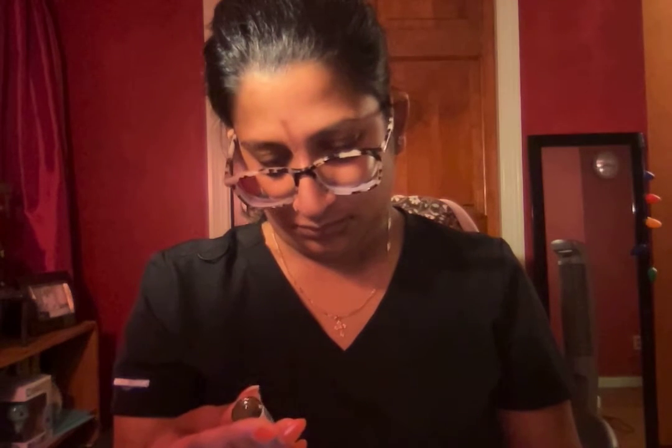I'm going to clean the top of this vial with an alcohol swab. Make sure it's clean. I'm going to inject the air into the vial and draw up the needed amount, which is 0.4. I'm going to make sure there's no air bubbles. Okay.